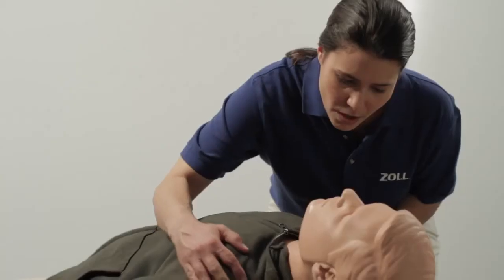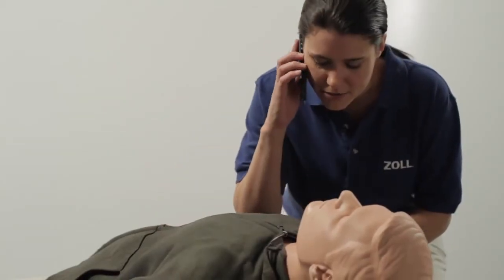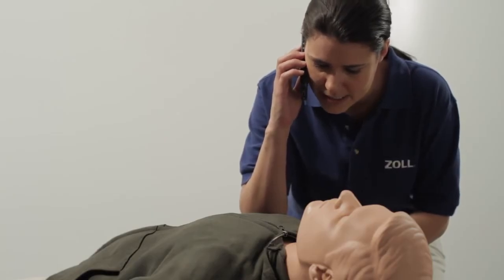Stay calm. Check responsiveness — are you okay? Call for help. The AED prompts you to call 911: "This is Julie Sanders. I'm at 445 North Park Avenue, and my friend is unresponsive. Please send help."